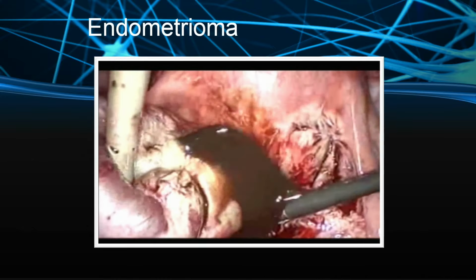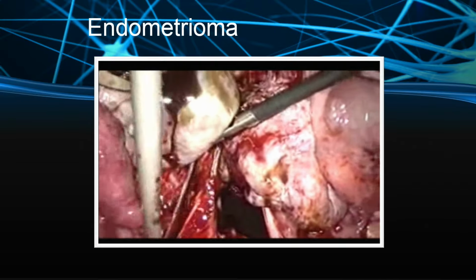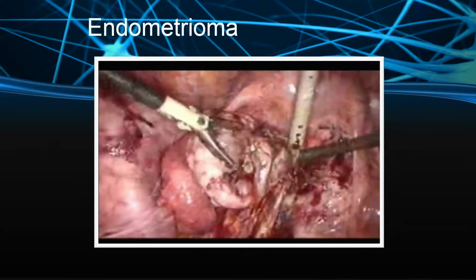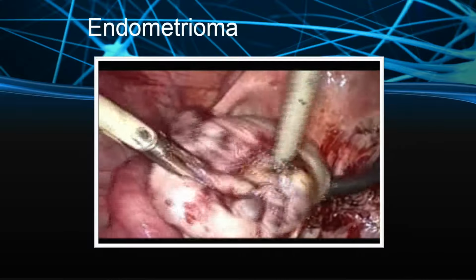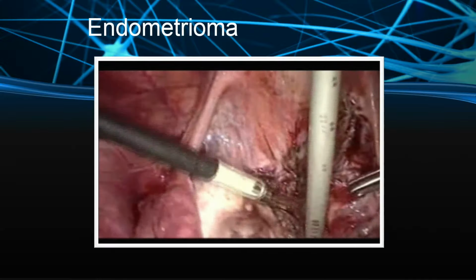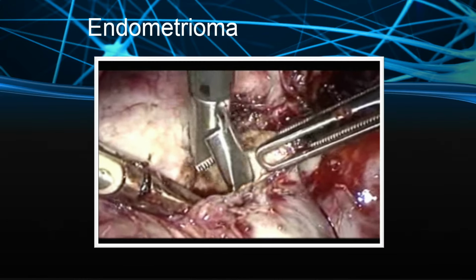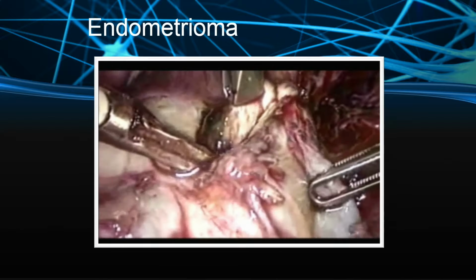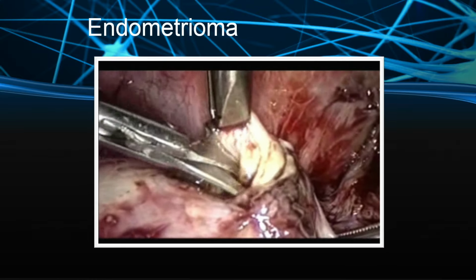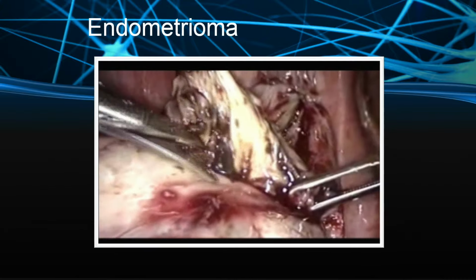Sometimes you can introduce the suction inside this rupture itself, so that you can suck it out. Do not allow this spilled fluid to go to the upper abdomen; immediately suck it, then introduce the suction inside. Now, dilute it and then suck it out, and after that tear at the same place where you have punctured, and hold the inner cystic layer with an atraumatic grasper and try to strip the outer cortex carefully. A combination of sharp, blunt and electrosurgical dissection has to be used. So, it needs experience. With experience you will be able to get a plane.